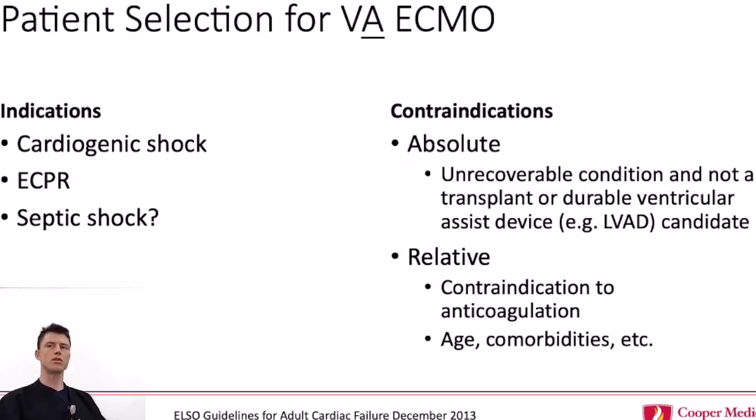We can think about eCPR, so someone in cardiac arrest, they get put on ECMO during cardiac arrest. I think that's something you guys will see in the near future at Cooper, how regular that would be. And then a question mark for septic shock. So you might think, hey, we have these patients who have this infection, they're in profound shock, they're on 3 pressors, why don't we put them on VA ECMO?